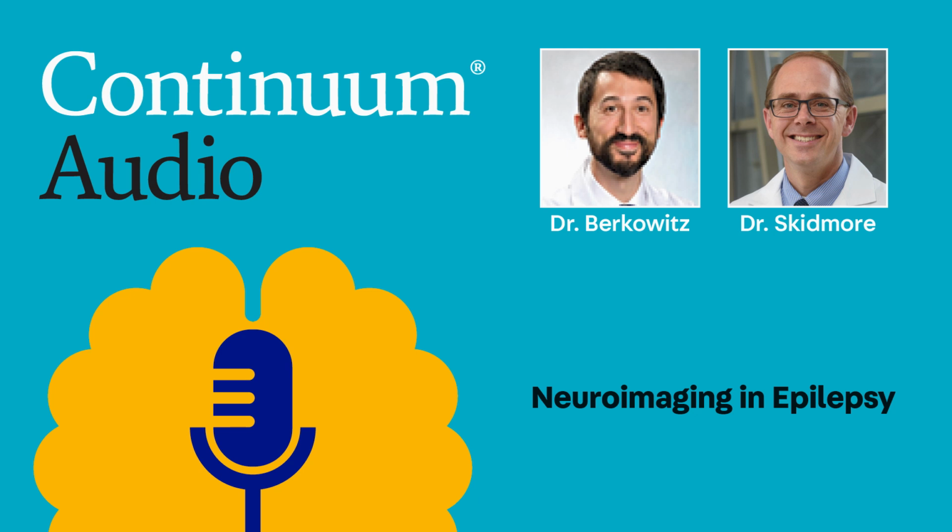So you mentioning to the neuroradiologist that we're looking for a cause of seizures or epilepsy, and epilepsy protocols for MRI.